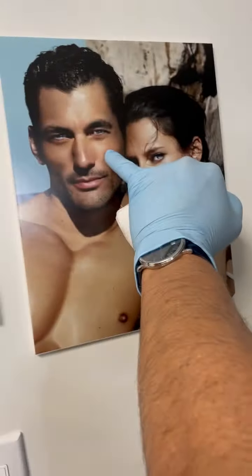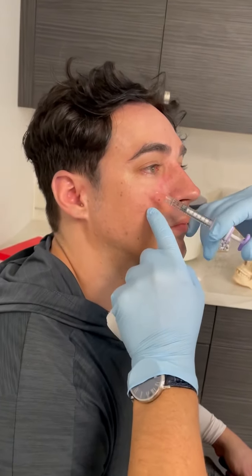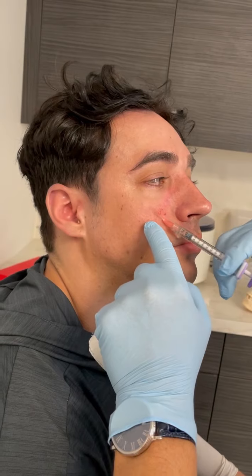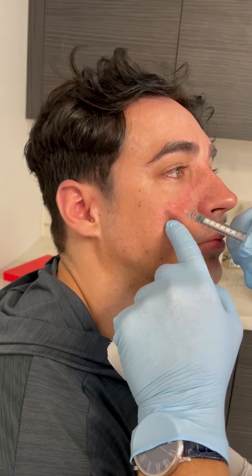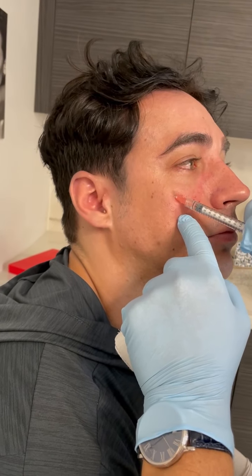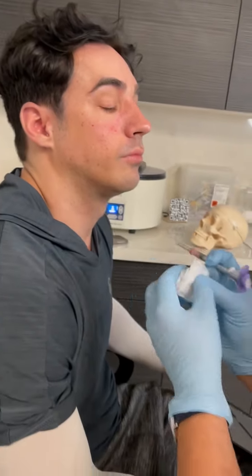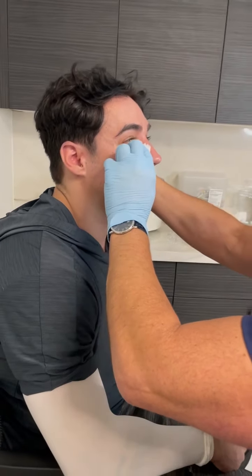So we did medial, we did midline, and now we're going to do lateral. So we're going to go here, again, on the bone, push. Another injection on the bone, inject. On the bone, inject. And on the bone, and inject. And that's going to give him that lateral arch. So we've used almost all of it, and now you could see that that's a very anatomical way of doing it.